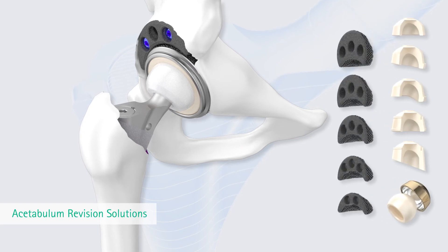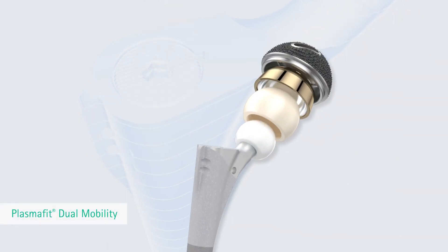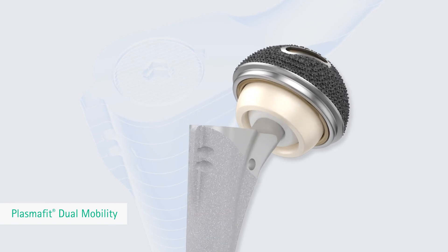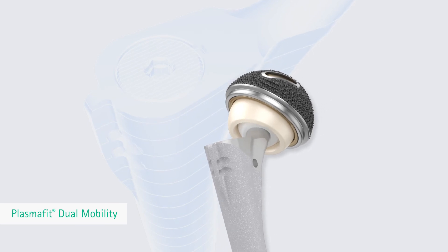In addition, Structon Augments can be combined with the PlasmaFit revision cup for treating larger defects. An additional treatment option offers the use of modular dual mobility liners that support post-operative joint stability with high range of motion.